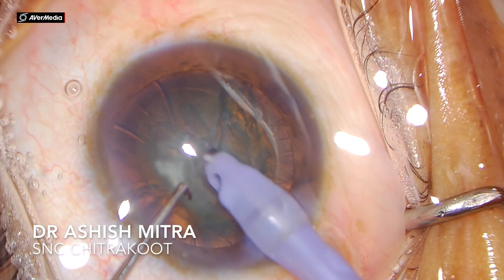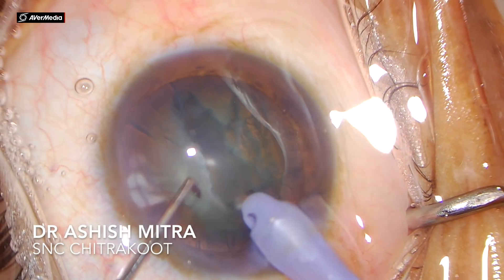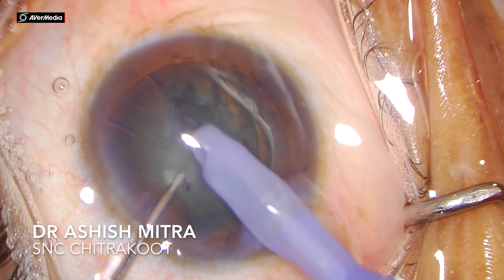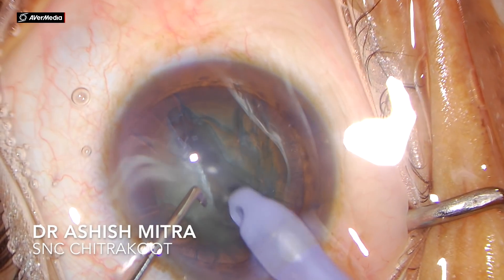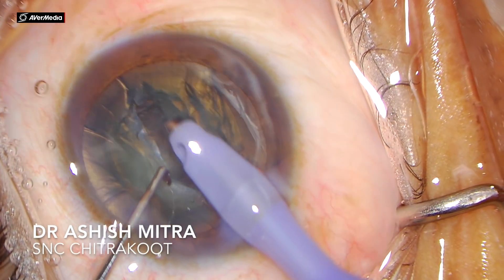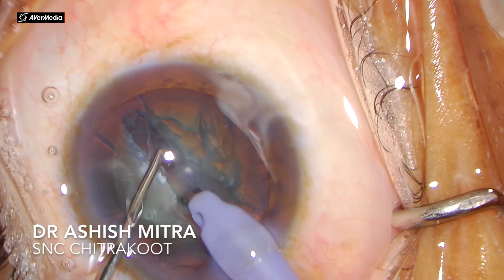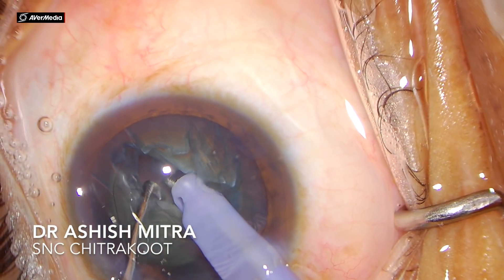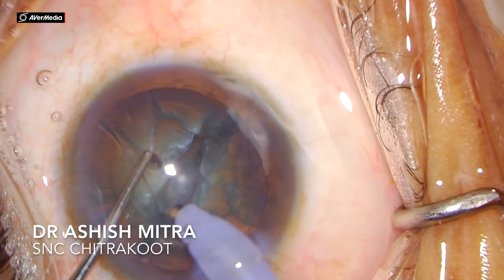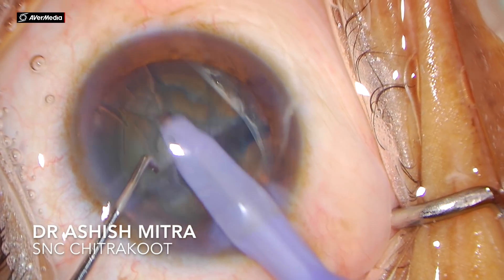I would be making a long and thin trench. Why long and why thin? Because the long trench you are making is basically covering almost through and through the length of the nucleus. It is thin because that becomes technically easy to crack the nucleus. The depth of the trench should cover almost 70 to 90 percent of the nucleus, and you should appreciate that red glow.